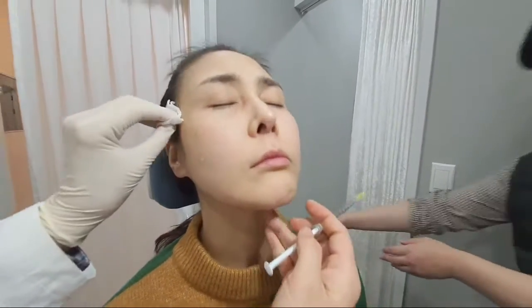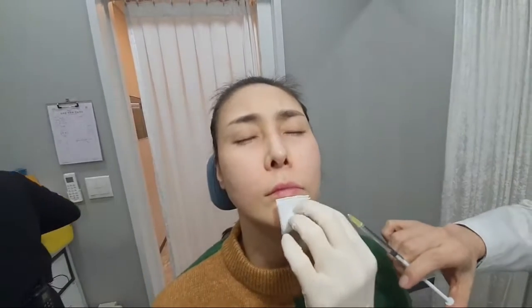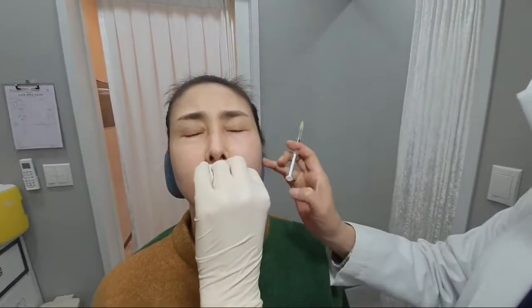So we're going to do anesthetic injections.